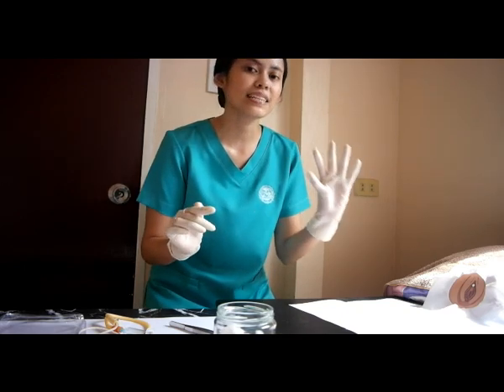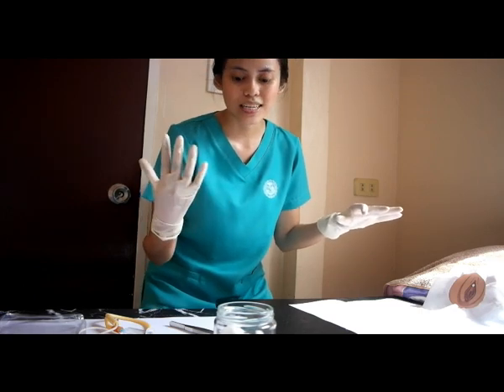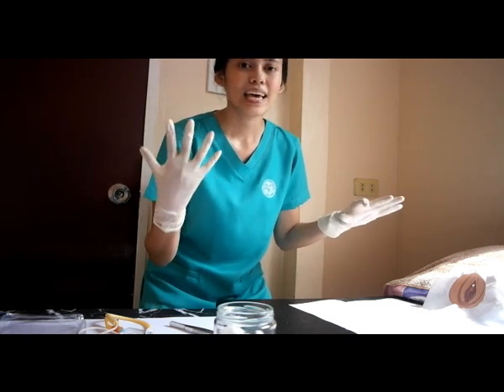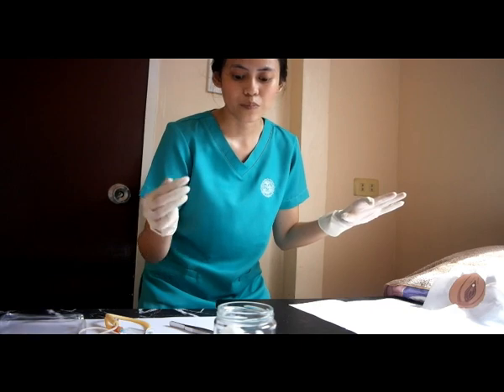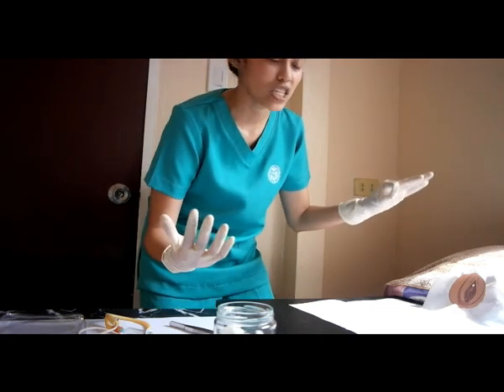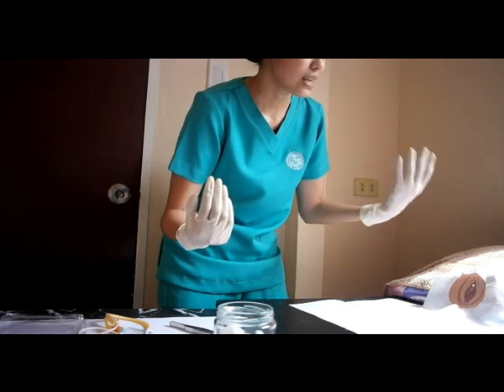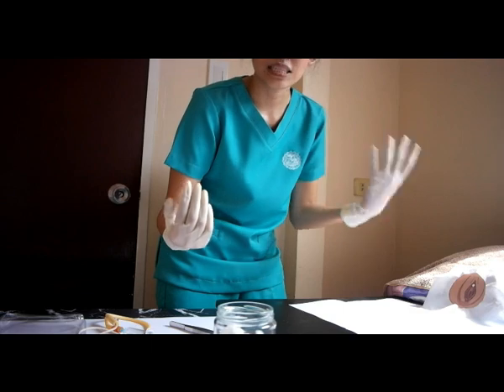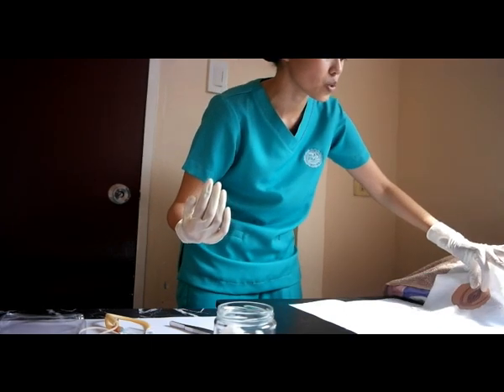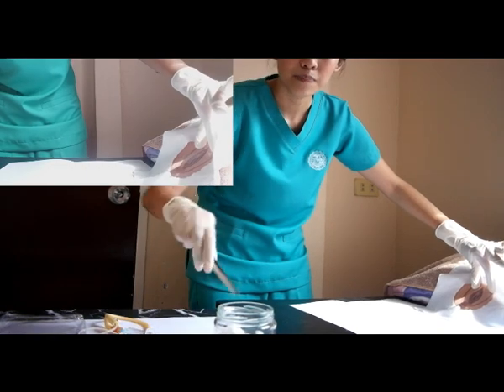So with your non-dominant hand, we're going to use it to spread the labia, while your sterile hand is used to pick the cotton ball with the forceps. So we're just going to firmly spread the labia with your non-dominant hand. The moment it touches the labia, it is now contaminated and becomes unsterile. So we're just going to use that to spread the labia, and we're just going to get the forceps and pick a cotton ball.